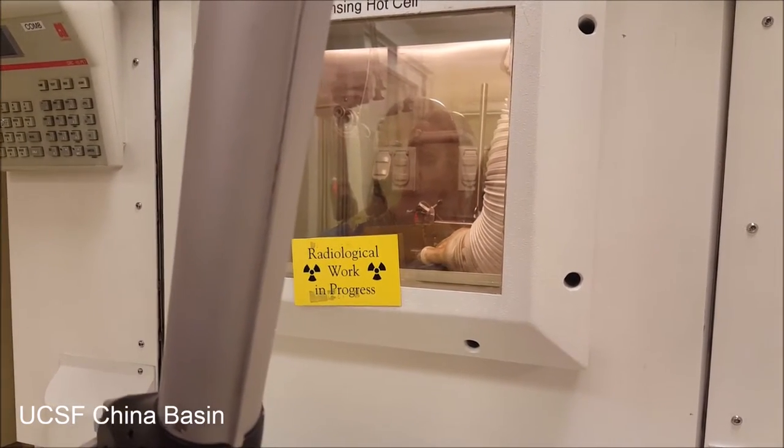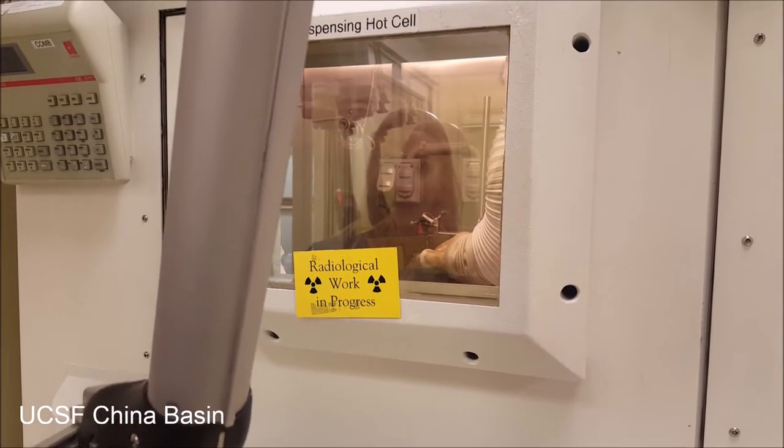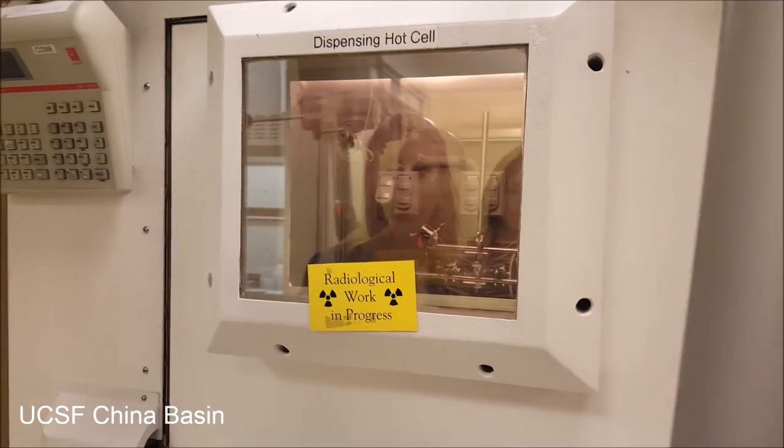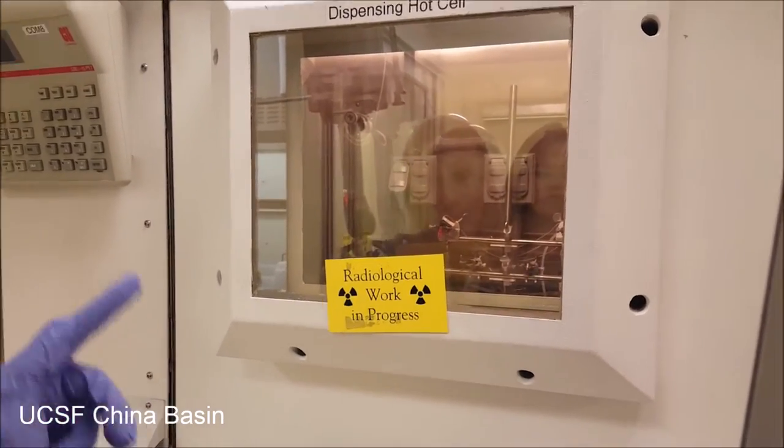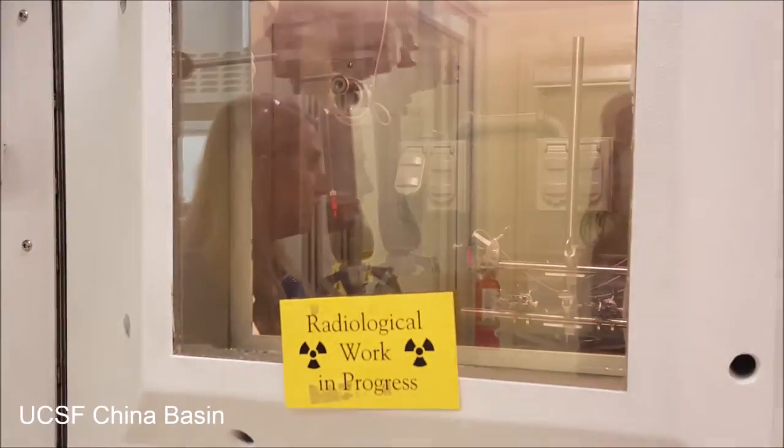We make a sterile final product vial in an ISO 5 area, and then we connect it here, and the last step that's going to happen in the synthesis is that product is going to go through a 0.22 micron filter, and that's just going to make sure that everything gets sterilized.